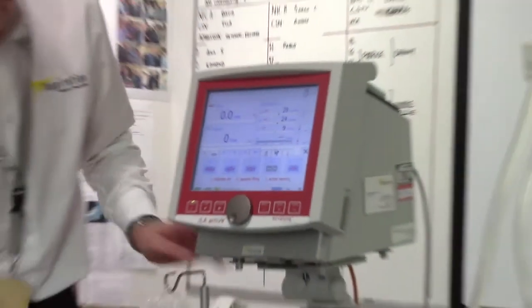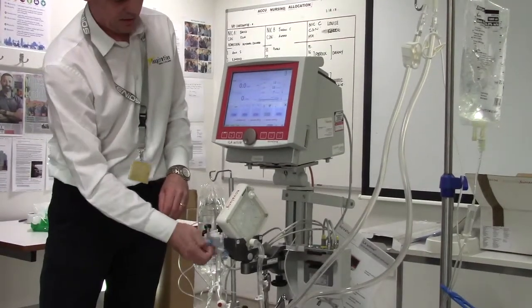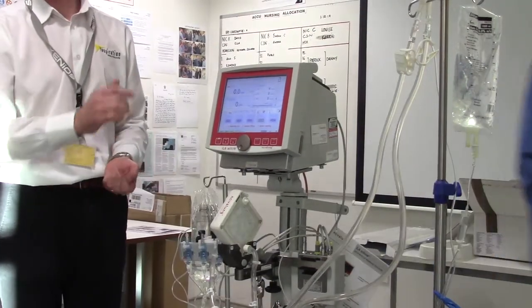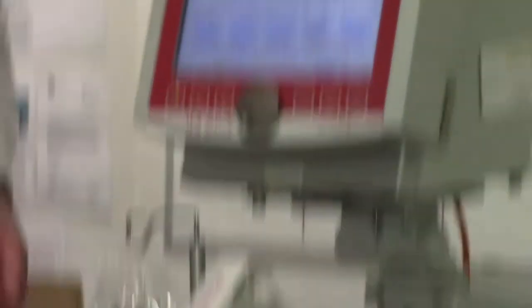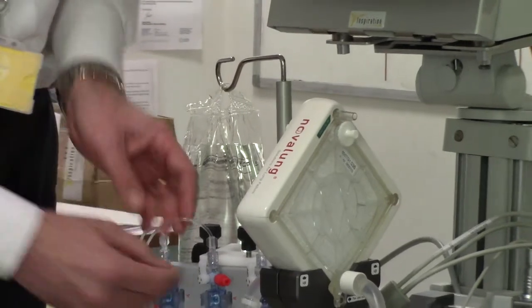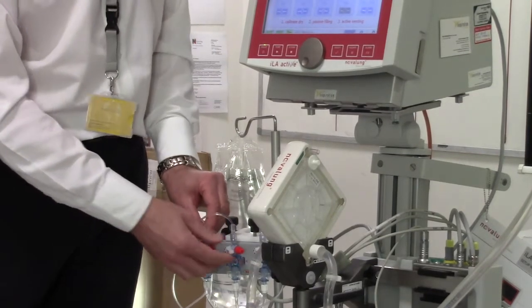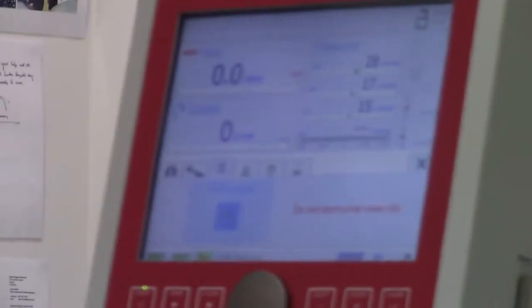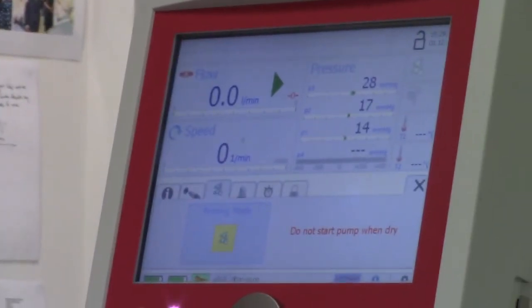It wants to zero the transducers first — taps up, ports out. You can press each one individually, or on the right-hand side press P1 to P4 and they all zero automatically. That needs to be done once a shift but not with a new system. Press X to continue, then it asks for priming mode. Press the priming mode bubble on the touch screen and it will go yellow, meaning you can prime the system without it alarming on air detection.